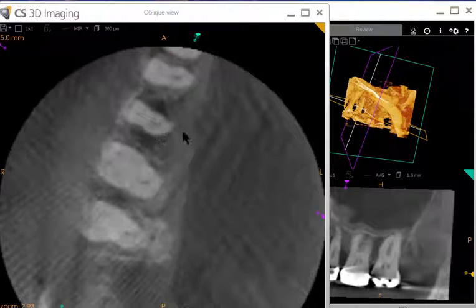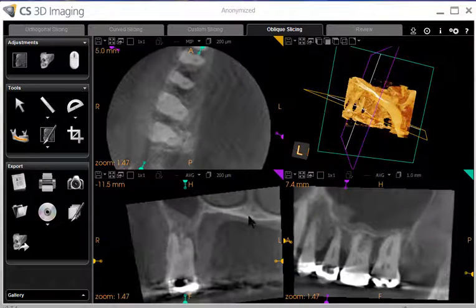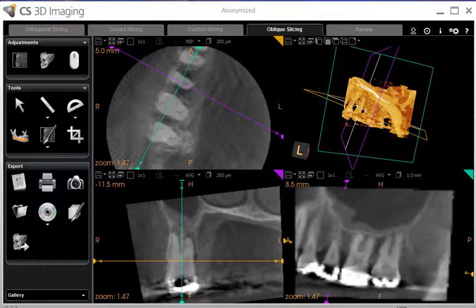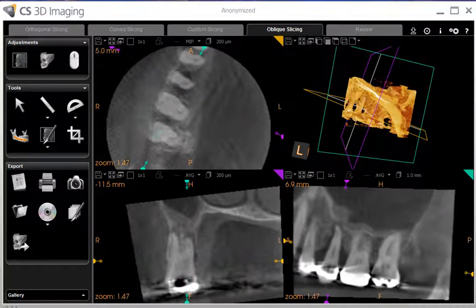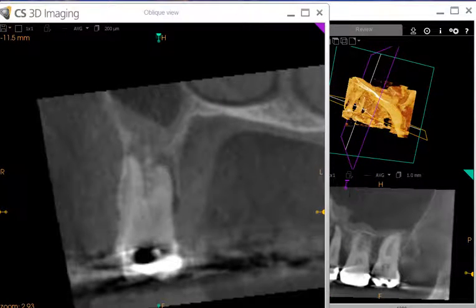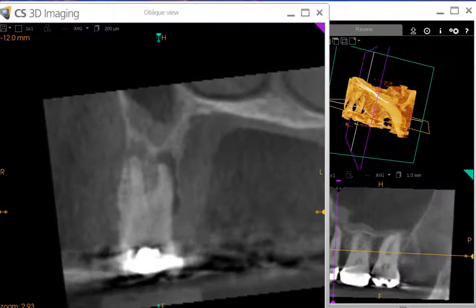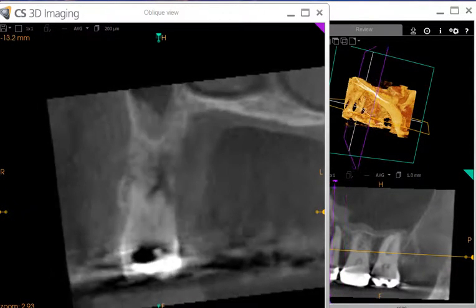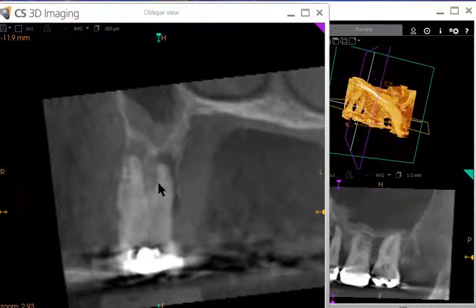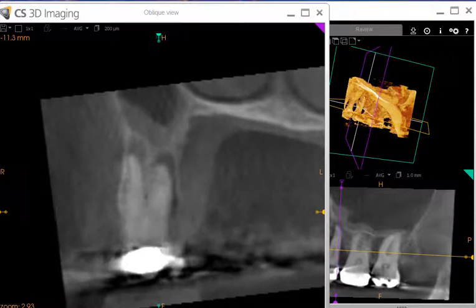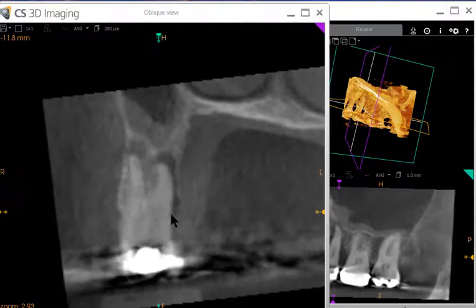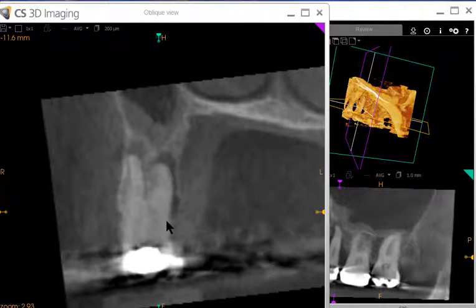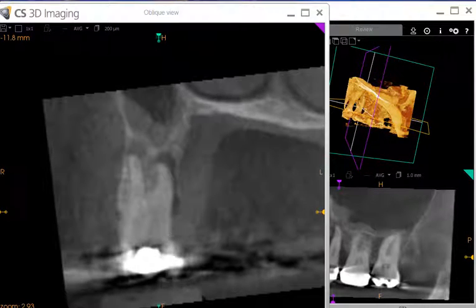Now I want to go to the coronal view. I'm going to blow it up, and again it's color coded purple. I can change both the long axis and the position that the slice goes through. Concentrate on this palatal root as I move the slice back and forth through the scan, and note the bone loss all up and down the root.